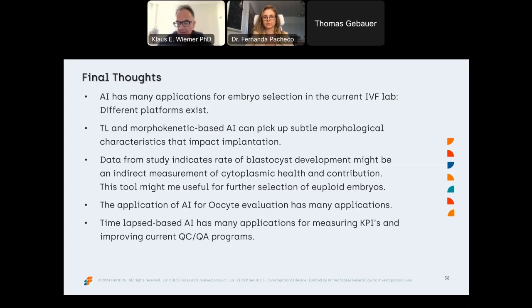This is an area that I'm working a lot in right now: trying to develop the ultimate quality control system for the laboratory, so that laboratory directors, regardless of where you are, will constantly know that your embryos are developing and dividing at their optimal rates, and have a platform to see how the introduction of products, staff, physicians, everything is impacting embryo quality.